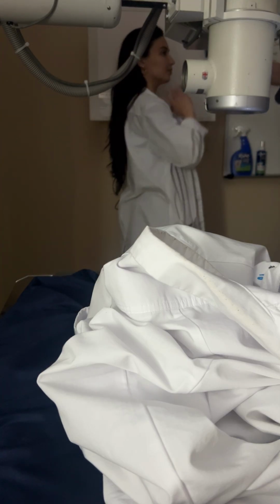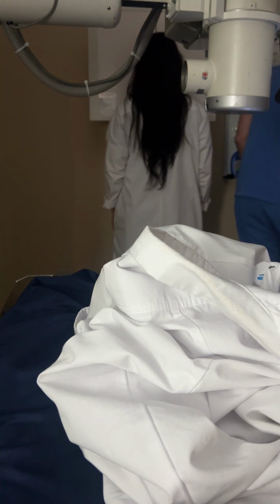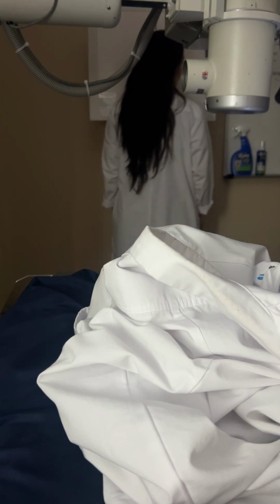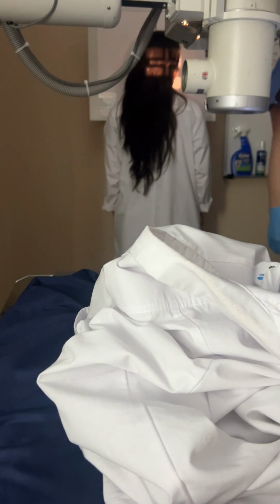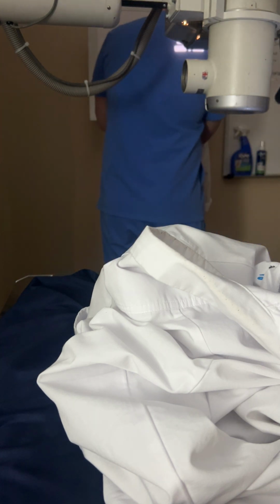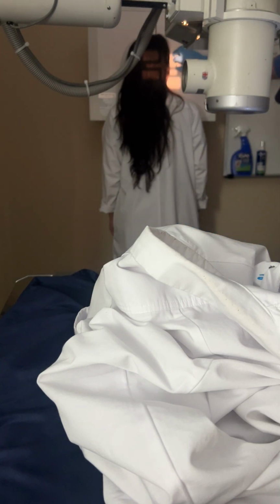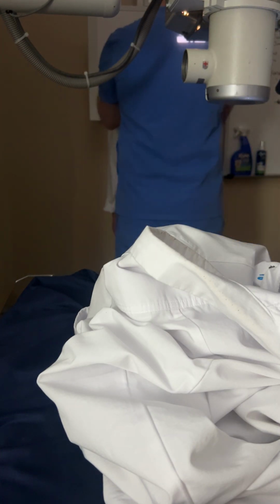For the Rhese method, aka the orbits, Rhese method, R-H-E-S-E. Sorry, my handwriting is terrible. You're going to do what's called the 3-point landing. Cheek, chin, nose, okay? Make sure you have that in your notes. You basically want the patient to be up against the board and have their cheek, their chin, and their nose in contact with the Bucky. If that's there, then all you have to do is make sure that your CR is exiting the downside orbit, okay?